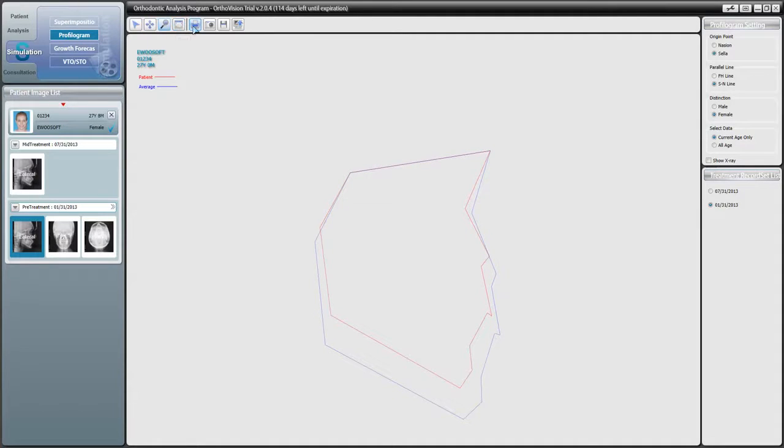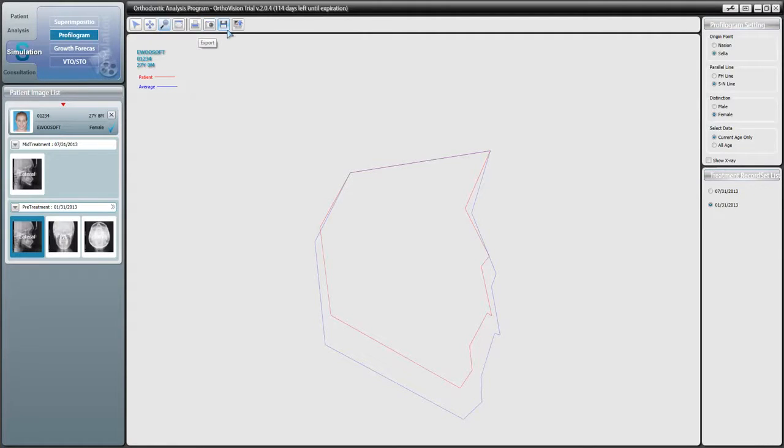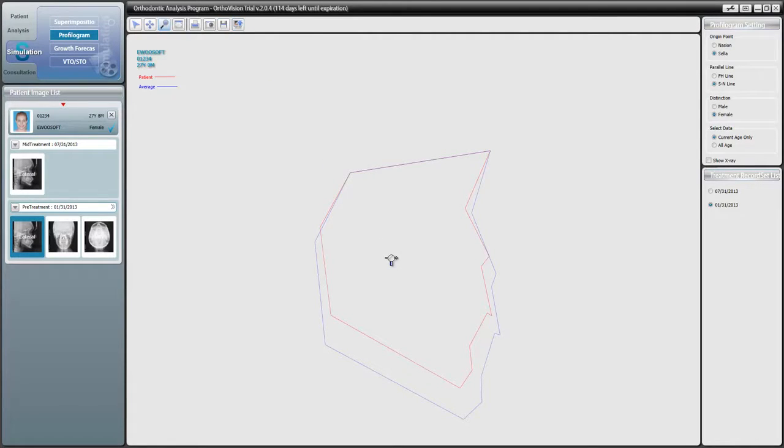Beside the camera tools, we have our exporting tools. The first being print, which prints out the image to your screen. The second being capture, which copies the image to your clipboard for later pasting into either a word processor or image program. The third being export, which allows you to save an image to your disk. And finally, image upload, which allows you to save it to the patient file in OrthoVision.